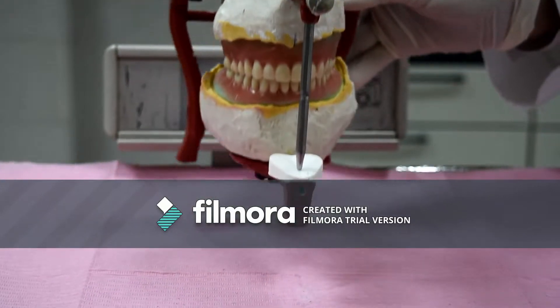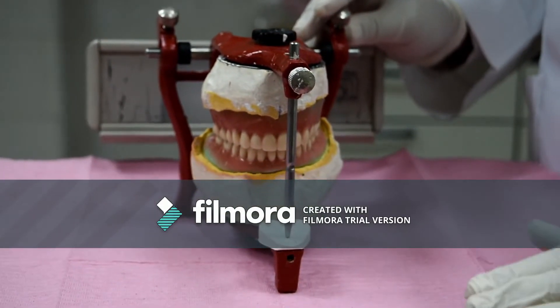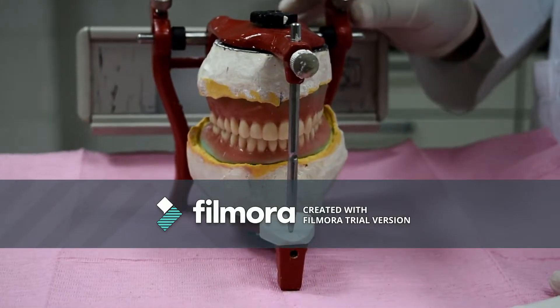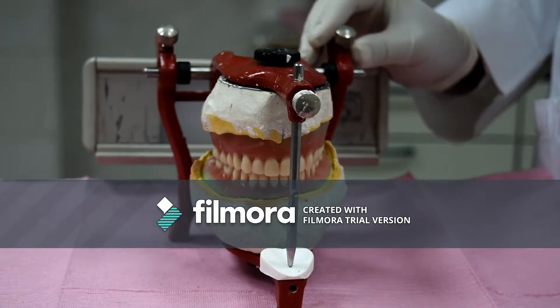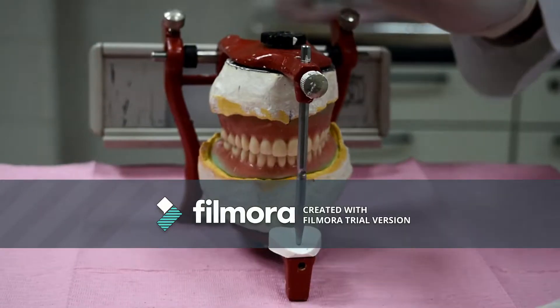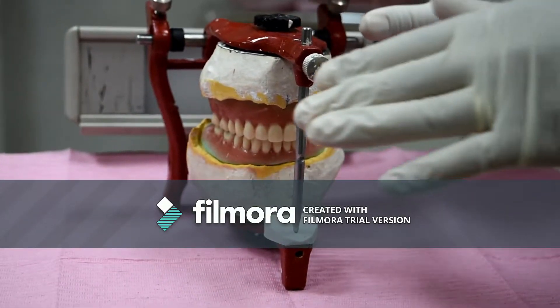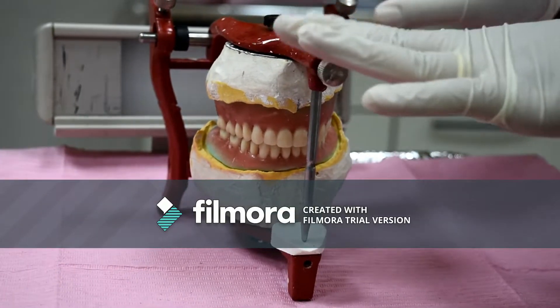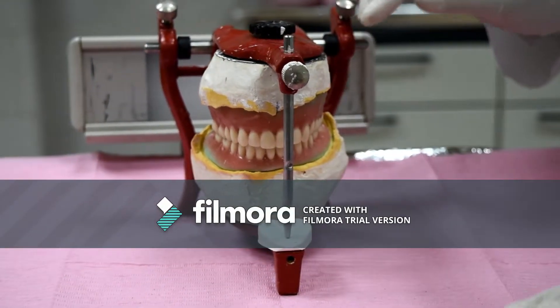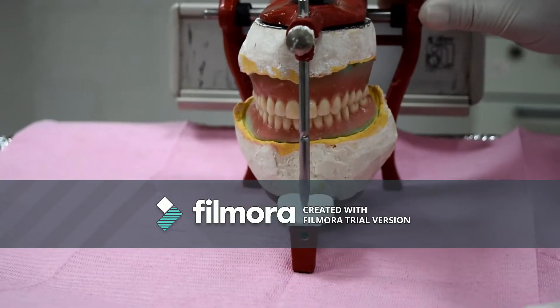The try-in step is a very important step that allows you to evaluate your denture while it is still in wax, so that any necessary adjustments can be corrected easily. First, you have to check your case on the articulator. You can check first the articulator itself, then the casts, the try-in denture bases, and the artificial teeth.